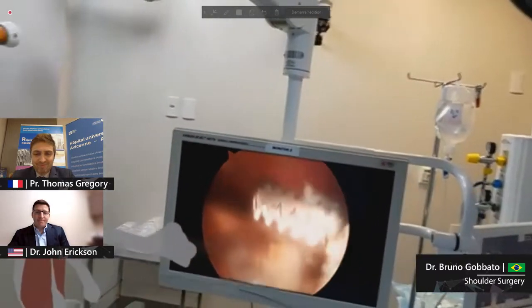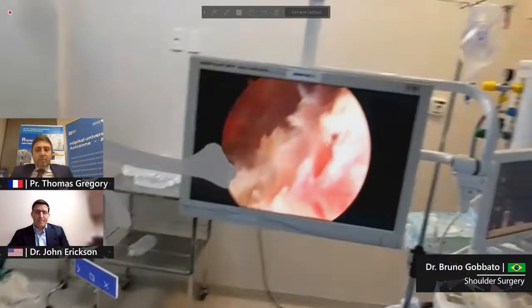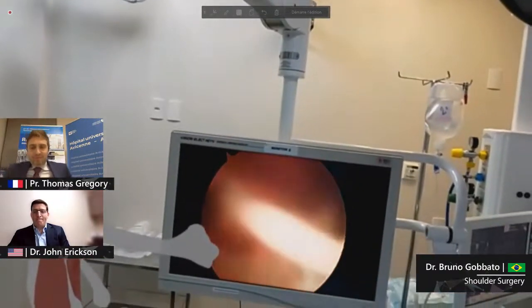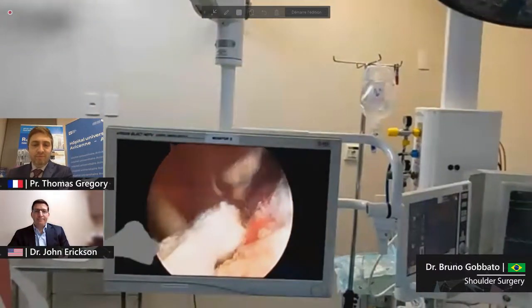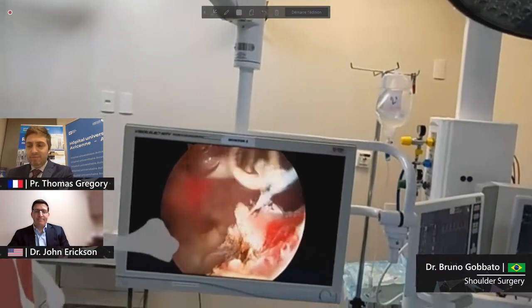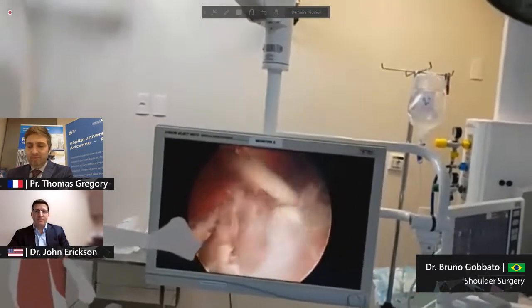Yes, and I think, John, that this device will be just like our smartphone. We use it for everything. As Thomas commented today on this subject, we will probably be using it for everything.